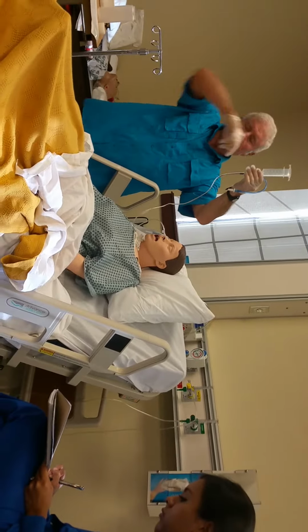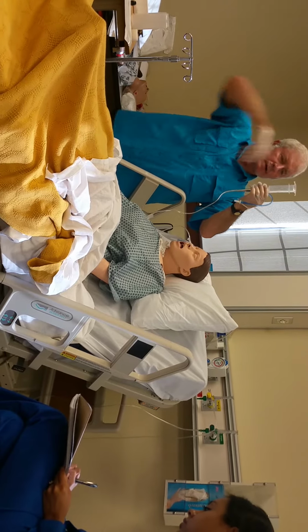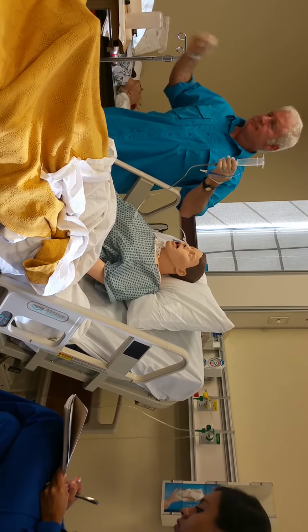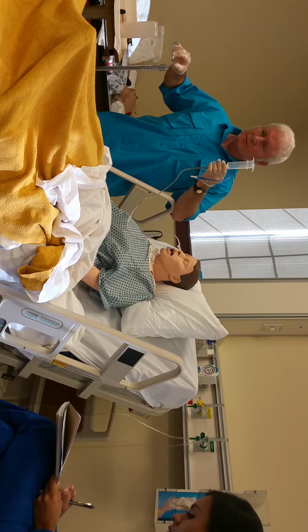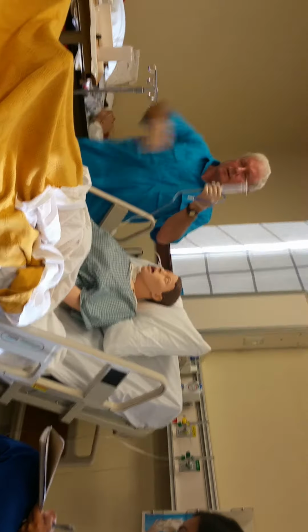Once I get that medicine in, then I've got another thing with water. I pour 30 mils of water in, let that flush through. Then the rule is you've already got your medicines pre-crushed before you get in there, however many you've got. Take the next medicine, put it in the cup, pour some water in there, mix it up really good, pour it in there, flush it with water, okay?